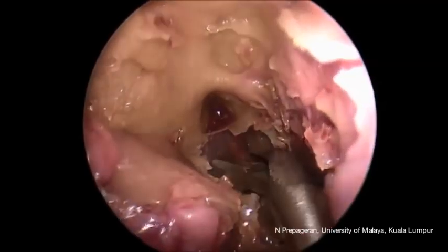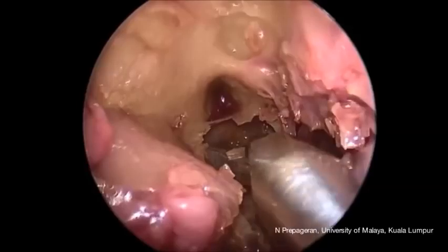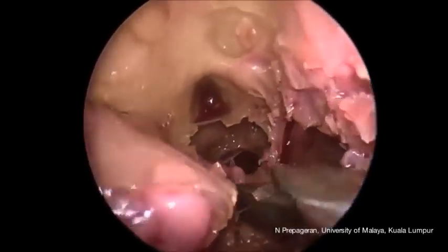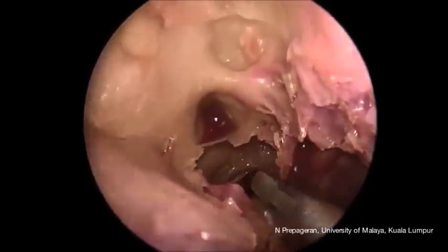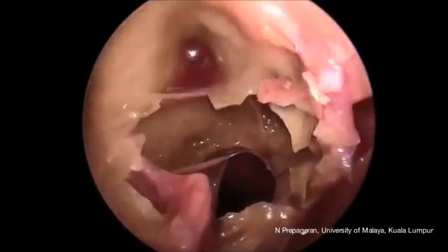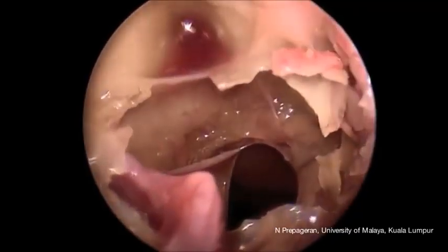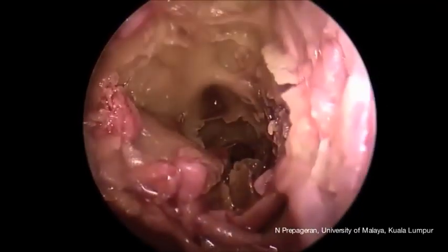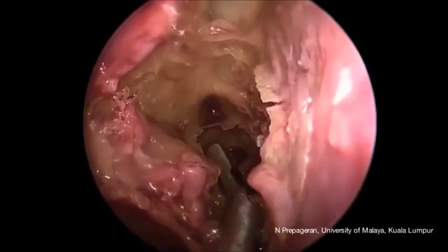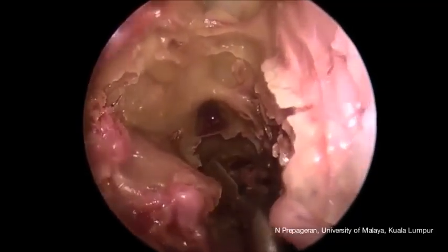and visualize the structures. Here we're going to remove the mucosa from the sphenoid sinus to show the structures of the sphenoid sinus itself, and removing the last remnant and attachment of the superior turbinate, and that is the view of the sphenoid sinus. Again, you can appreciate how the posterior ethmoidal artery is only a few millimeters anterior to the anterior wall of the sphenoid sinus.